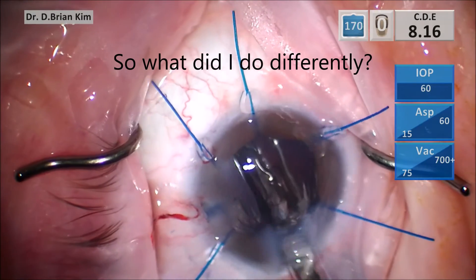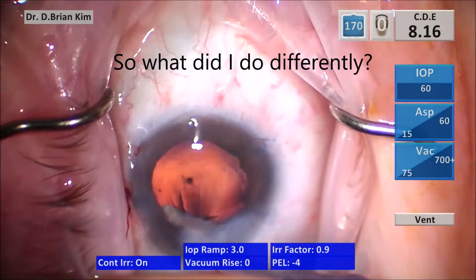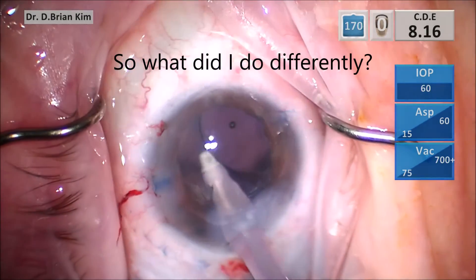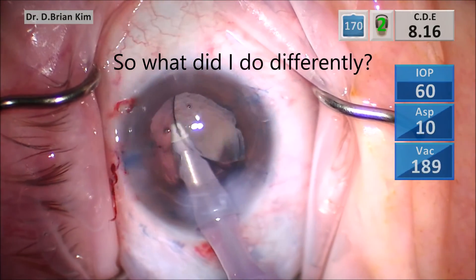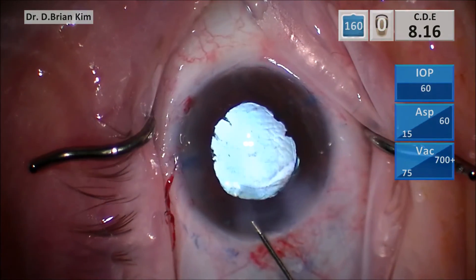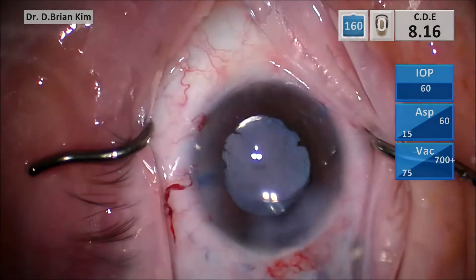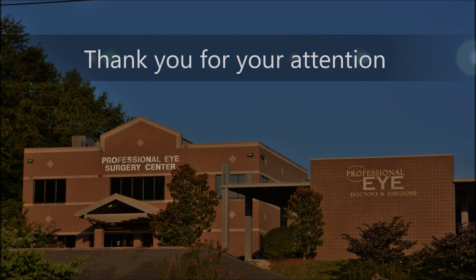To summarize what I did differently: I performed successive chop maneuvers without phaco or ultrasound or vacuum; I went deep with the placement of my phaco tip to achieve a deeper posterior chop and attack the posterior plate; I always pulled fragments centrally into the central safe zone; and I used gentle emulsification — the CDE was less than double digits. This patient did exceptionally well with very little ultrasound energy, and you can perform this type of surgery as well. Thank you for your kind attention.